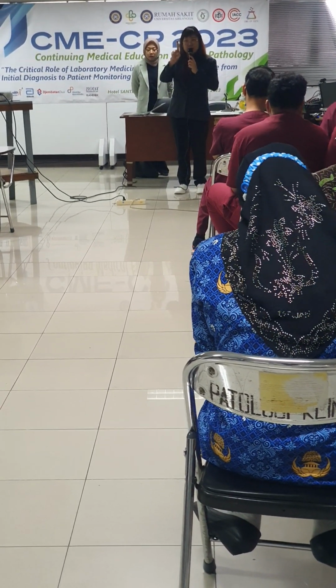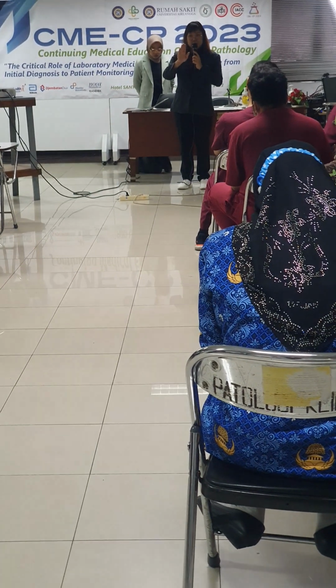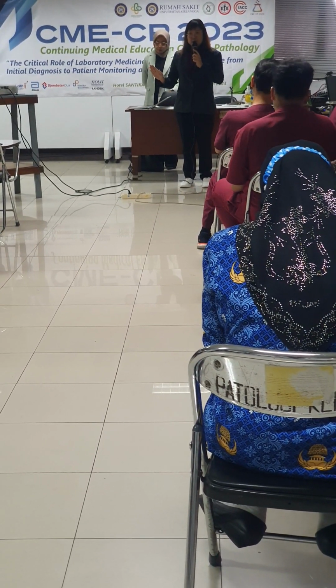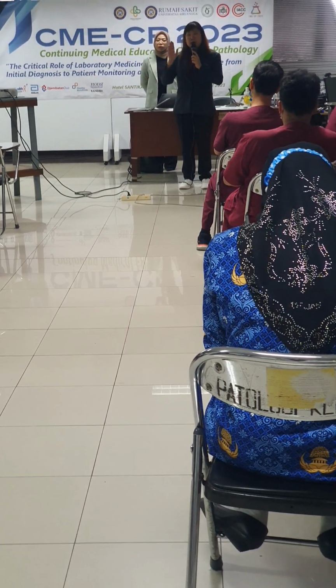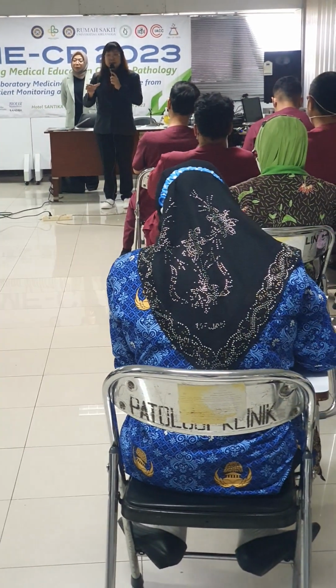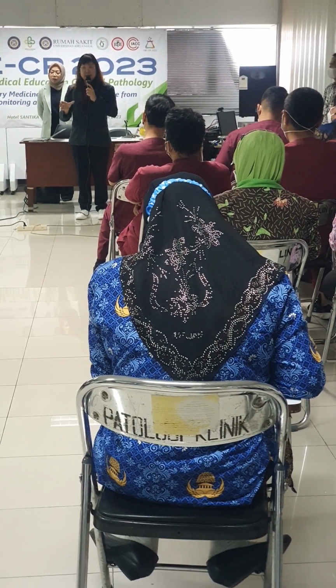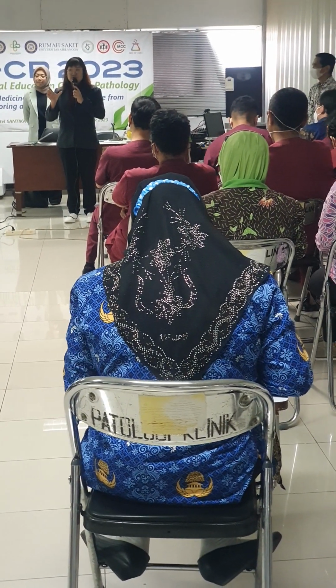So for the 96 one time use, it doesn't matter whether you have 30 samples, 45 samples, 50 samples, not yet even ready. Throw it away, the rest will not make time loss because that's just a plastic. The most crucial is the reagent.